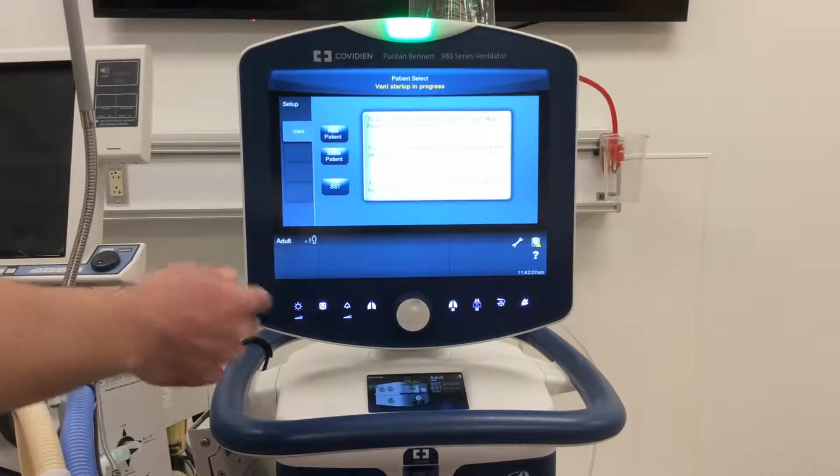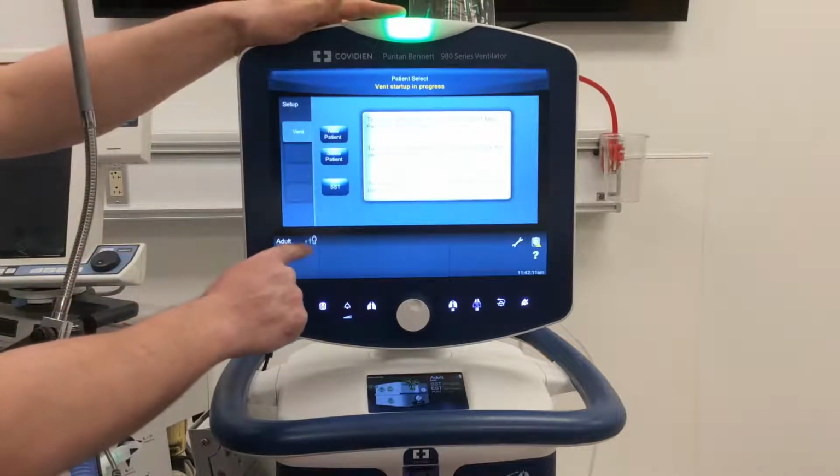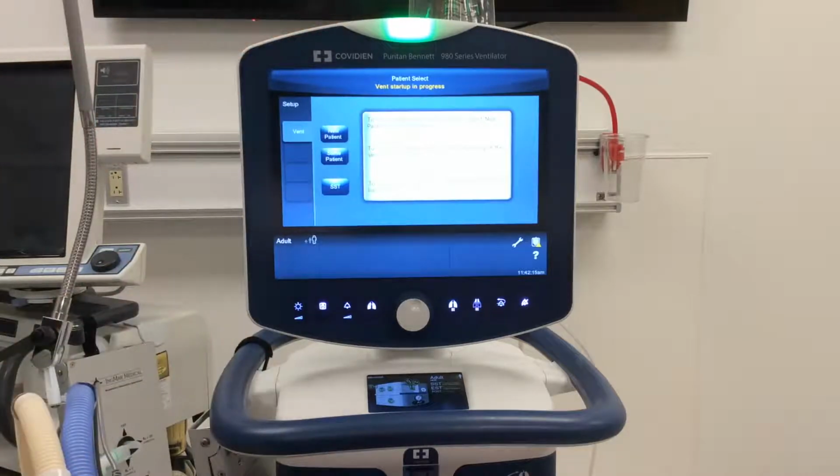All right, so first off, I'm going to hit new patient here in a second, but it shows you how to choose the proper patient size and everything like that. This does go all the way down to neo. However, if we were going to get out of the adult mode of ventilation, we would actually have to put a neonatal circuit on this thing and then actually go through that short systems test for it to be able to allow us to do so.